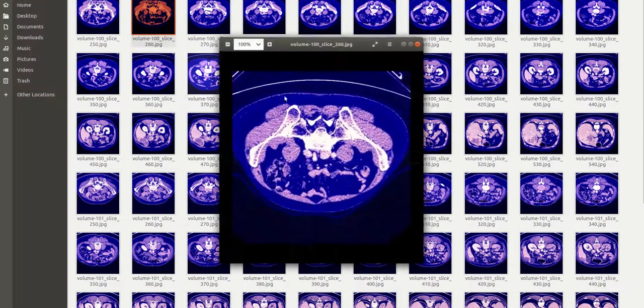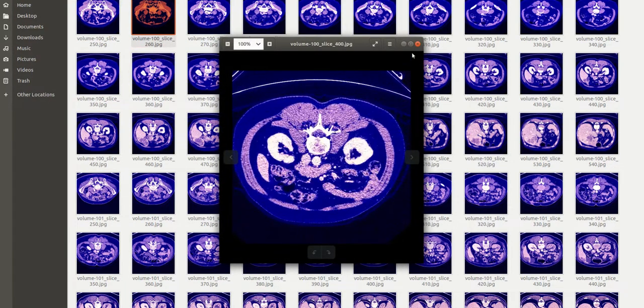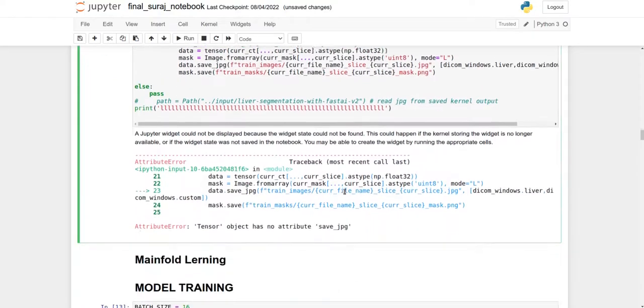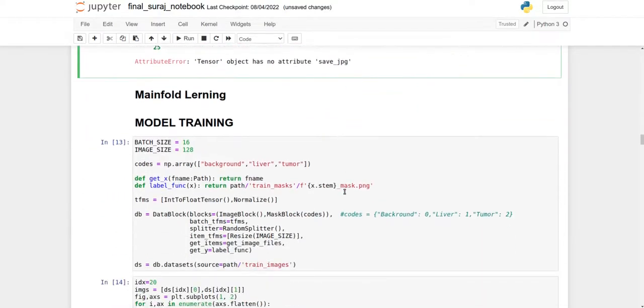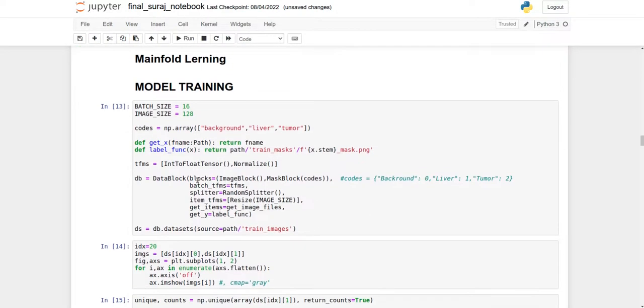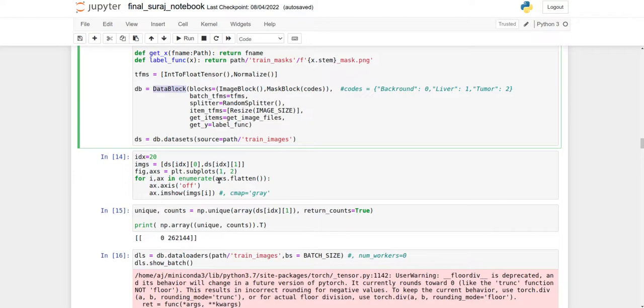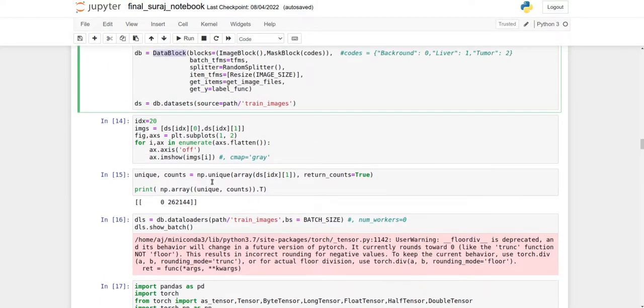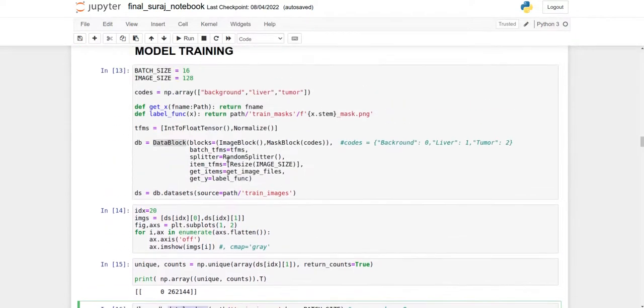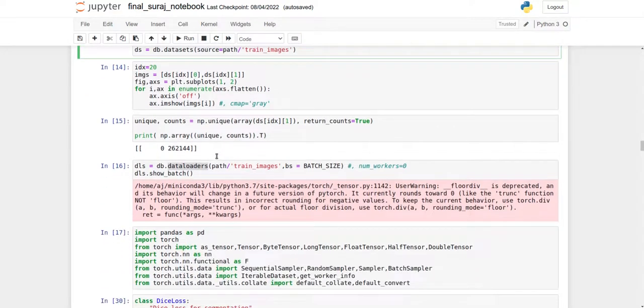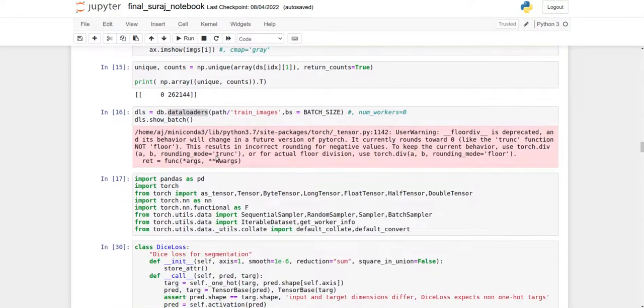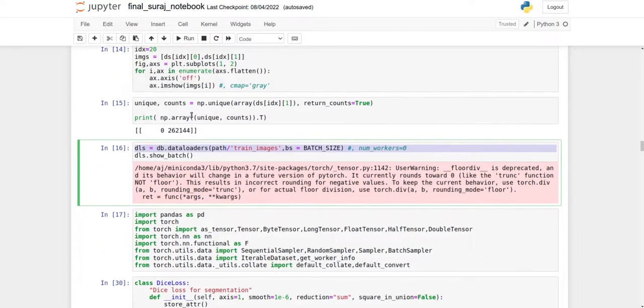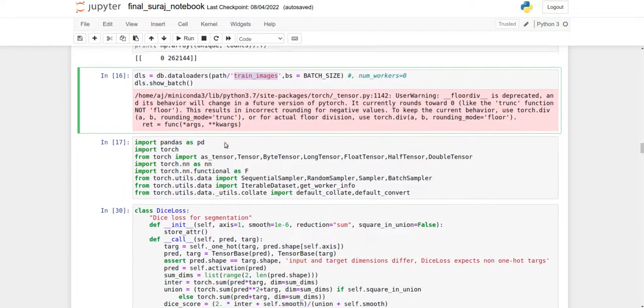This entire method saves the images by walking through directories, reading the dataframe, converting to 2D images, and saving them. These are slices of liver images. Now we move to the training part. FastAI enables efficient model training using DataBlock, which creates a pipeline that supplies data to the model sequentially. You can resize images in the DataBlock and declare the batch size. Once you have the data loader created, just give the path to the folder with your training images.